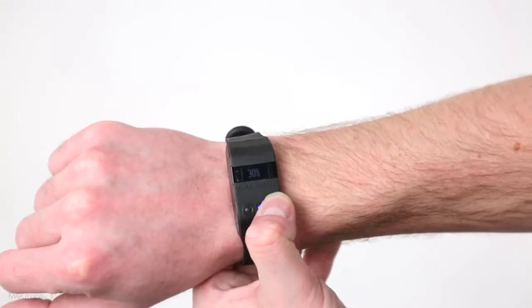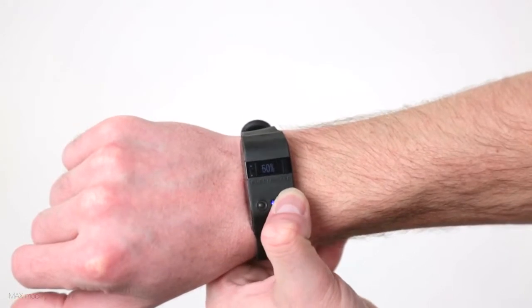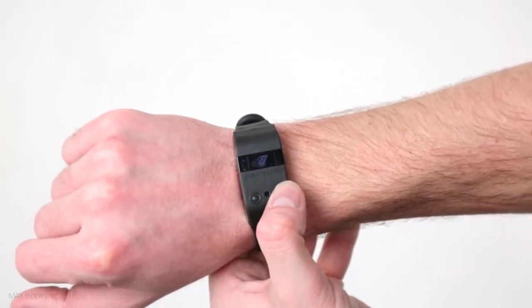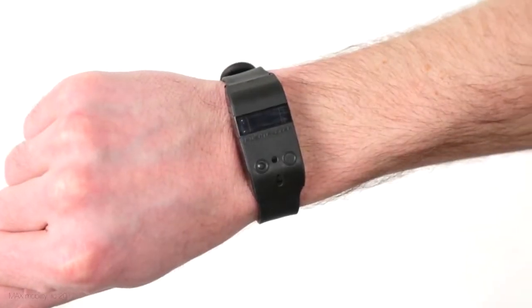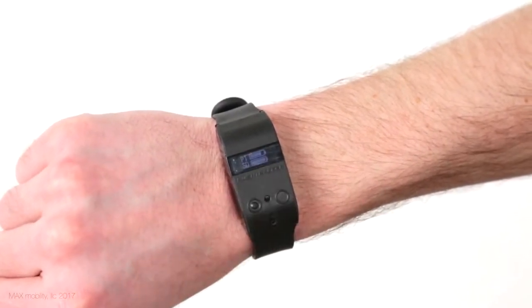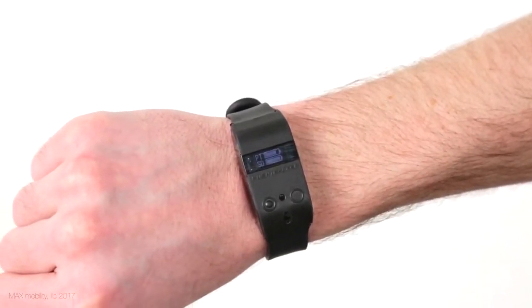Whenever your smart drive is driving you, the PushTracker shows your current speed in either miles or kilometers per hour, which I will show in a bit how to easily switch between in the settings menu. Anytime other than while you're driving, giving a small tap to the PushTracker will activate the OLED display, the major improvement of the PushTracker over the wristband of old.